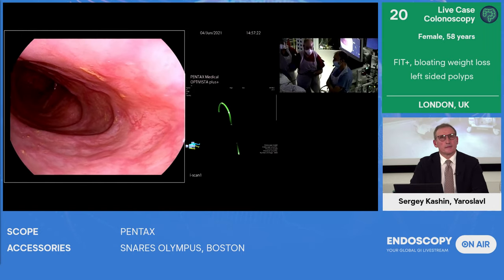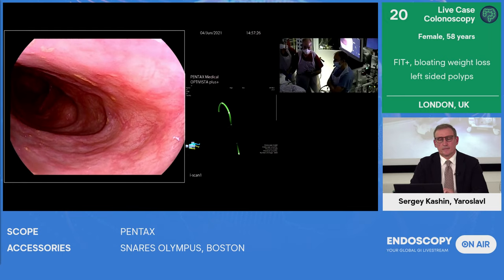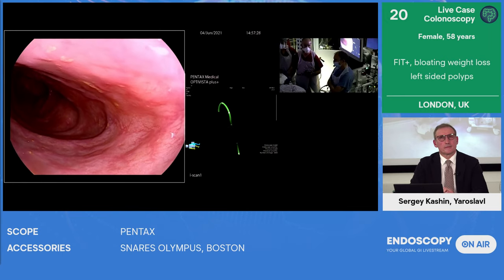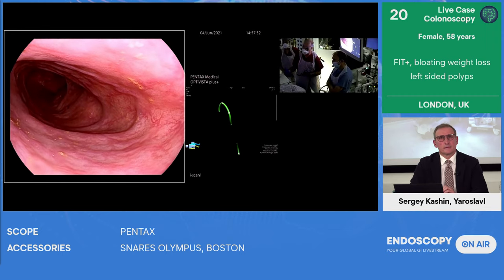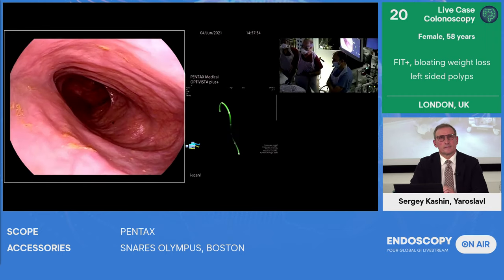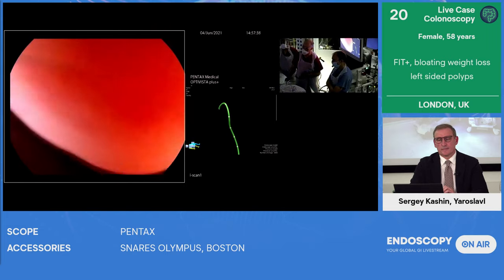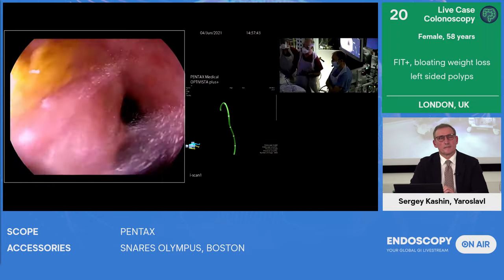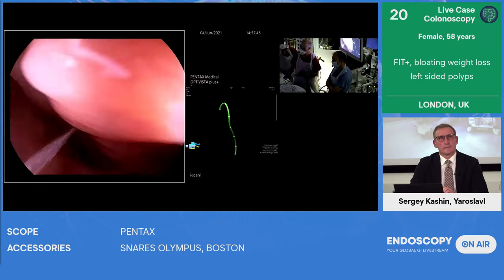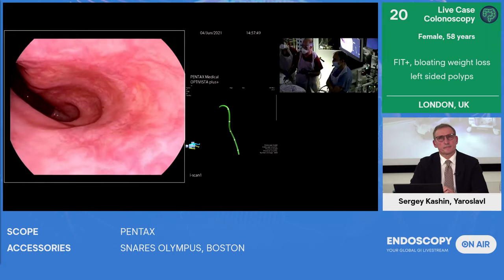One thing that's crucial when you're examining the colon is that the colon is under the influence of gravity, and you should be proactive in changing the patient's position. So here we've come back around the hepatic flexure, or in the transverse, and it's starting to be a little bit collapsed. It's more difficult to change the patient's position under propofol because she's asleep, but you should still do it, particularly if there's concern or you need to get good access for polypectomy.